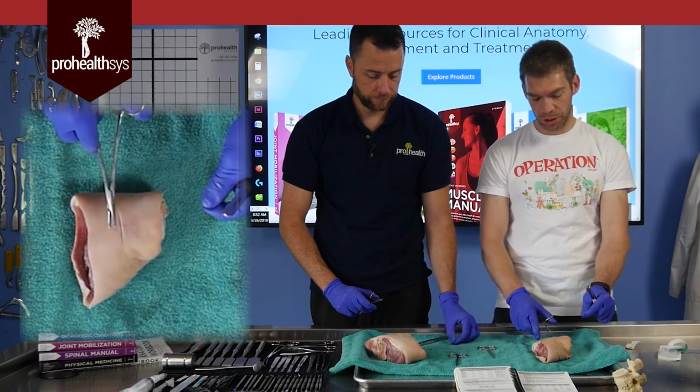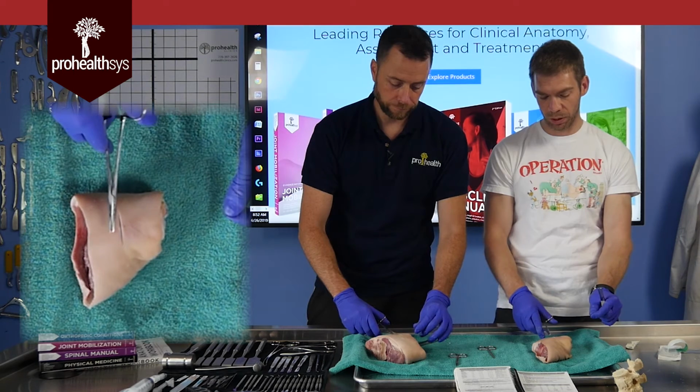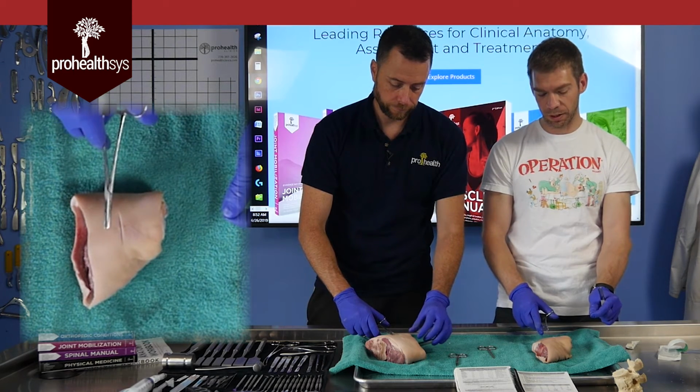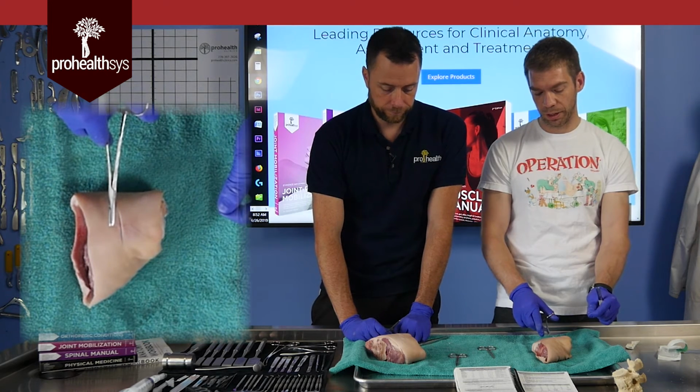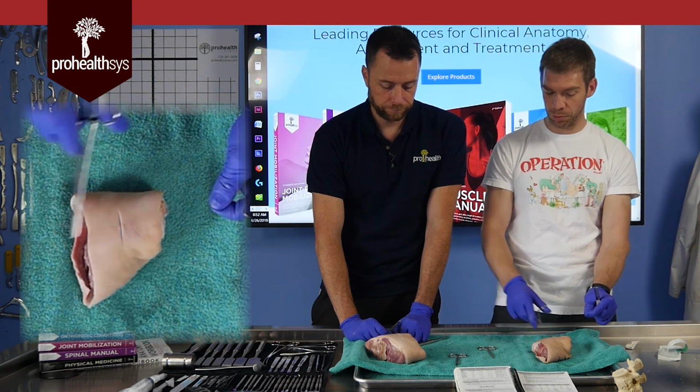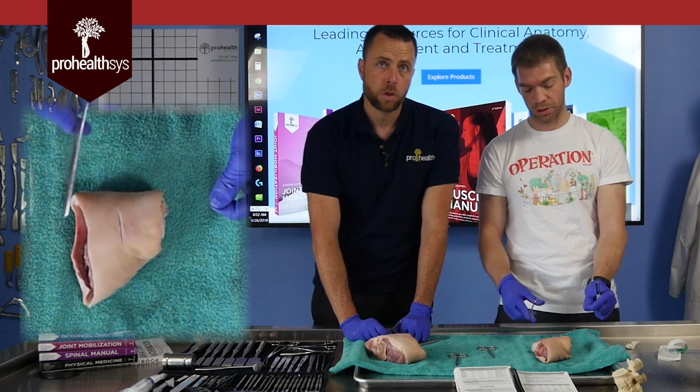The next thing I'm going to do, I'm going to make sure I pull my suture across so that I'm not wasting too much at the end. I want about 1.5 centimeters at the end. So in the end, eventually this is just going to get cut off. And if you've got a foot of suture material sticking out, that's all wasted. It's gone. And you'll have to do like 50 sutures to do 2 stitches.